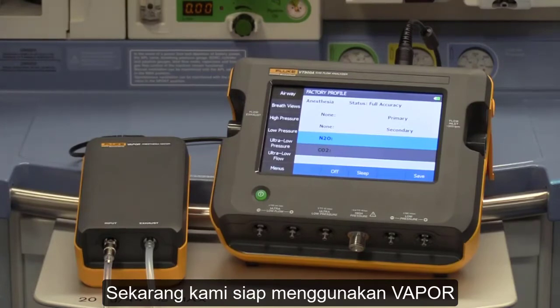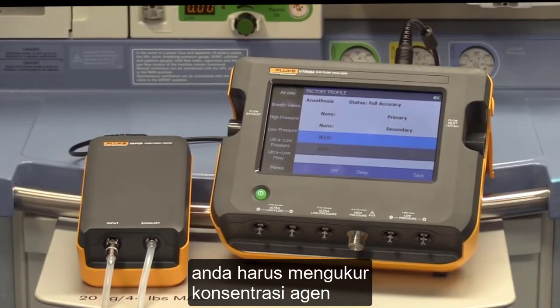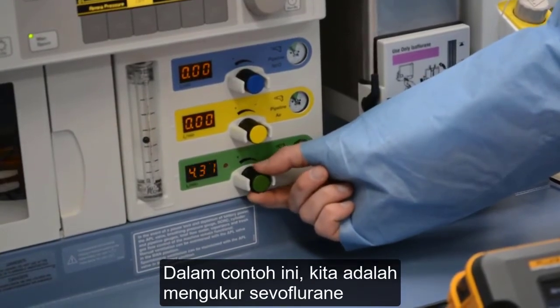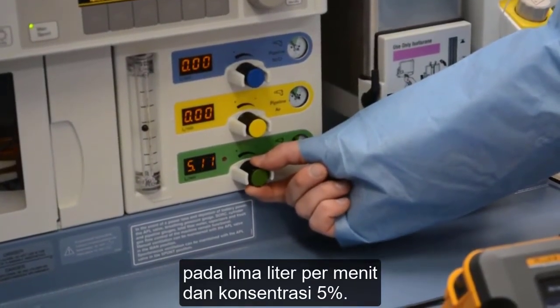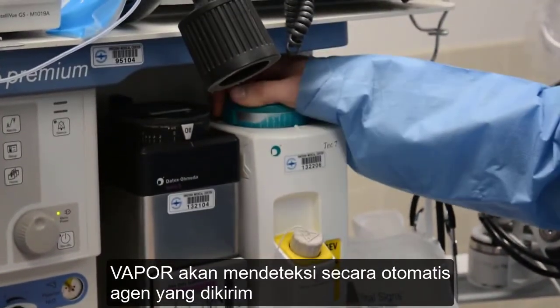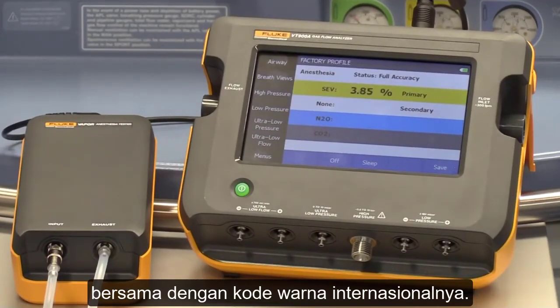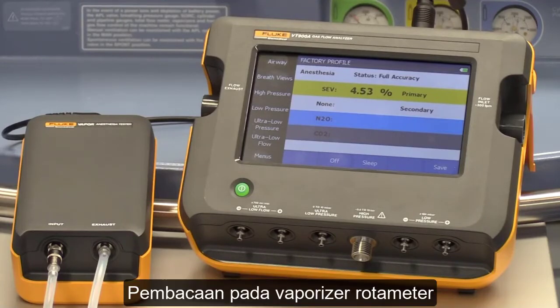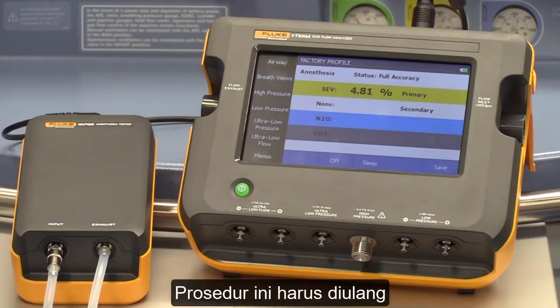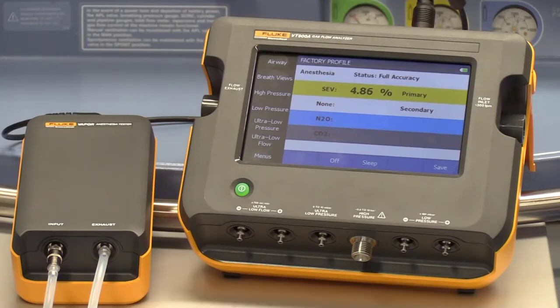Now we are ready to use vapor to verify the anesthetic agent concentration. You will need to measure agent concentration at multiple concentrations and flow rates. In this example, we are measuring sevoflurane at 5 liters per minute and 5% concentration. Vapor will automatically detect the agent being delivered and display it on the screen along with its international color code. The reading on the vaporizer rotometer should match the reading on vapor within acceptable tolerances. This procedure should be repeated for all flow and concentration test points listed in the service manual.